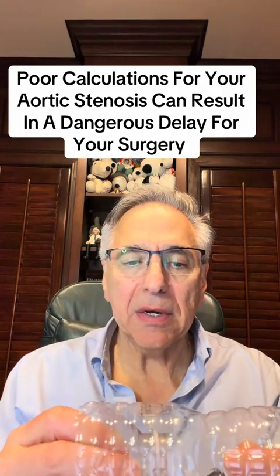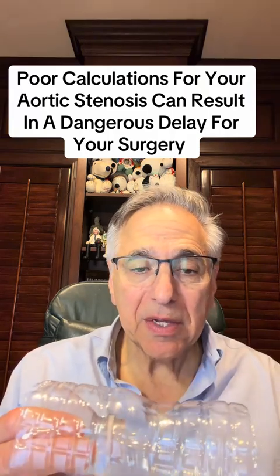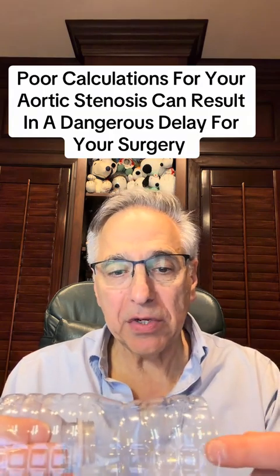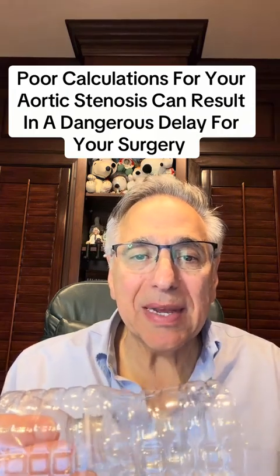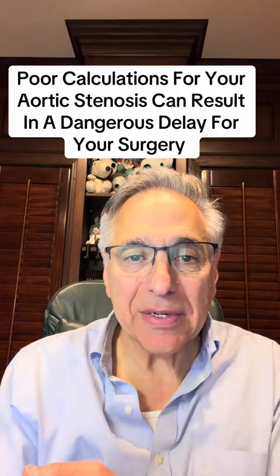What happens here? According to the continuity equation, the same amount of blood that is here flows here, as here. Has to. What happens? It's like pinching a hose. The velocity increases. And so we know if we measure three things, I'll use a tape measure, but if we measure what's called the left ventricular outflow tract here, we can't measure the valve, it's too difficult.